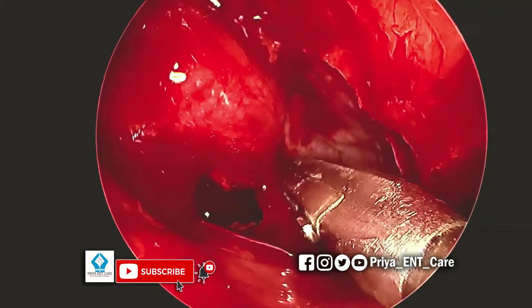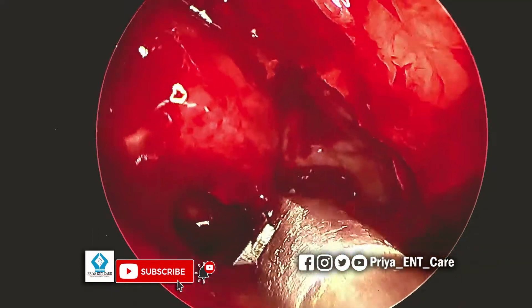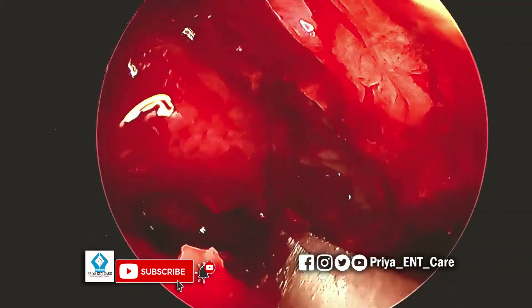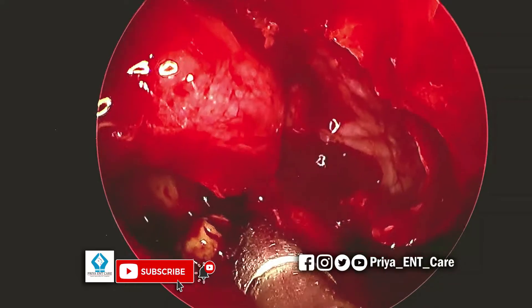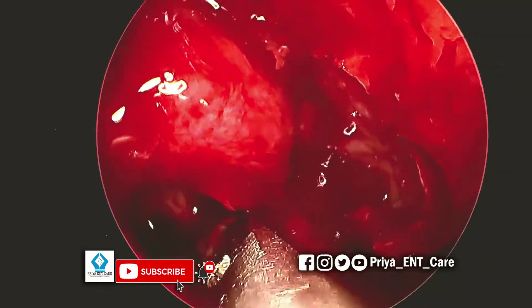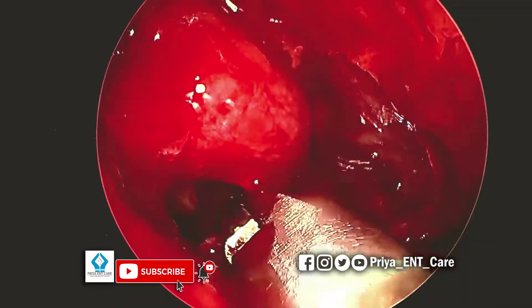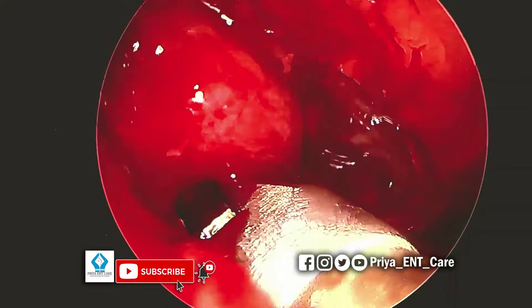Using the reverse antrum punch, antrostomy is being widened. Using the microdebrider, the cut tissue is being removed.